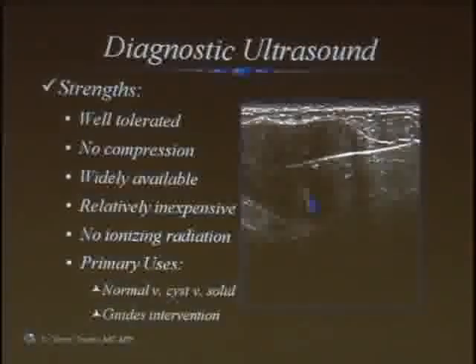And it guides intervention. It's real time. It's like shining a flashlight right through the body. You can see things in real time, and you can watch the needle go right into the lesion. It is incredibly accurate for biopsying. It's the best way to biopsy something that you can see.